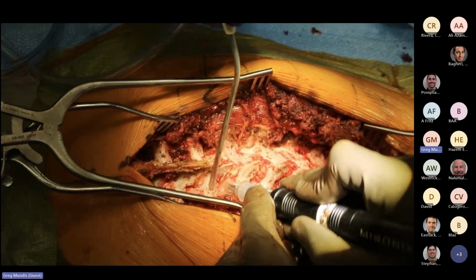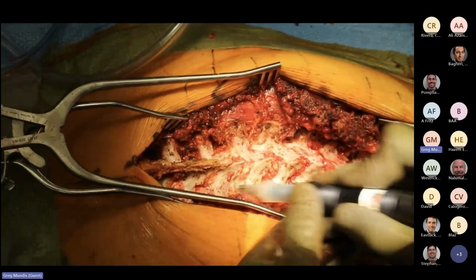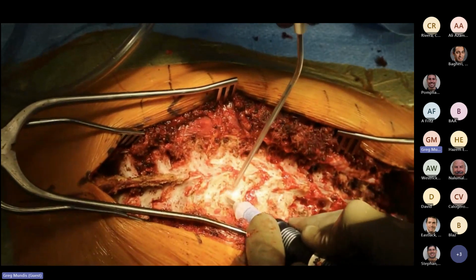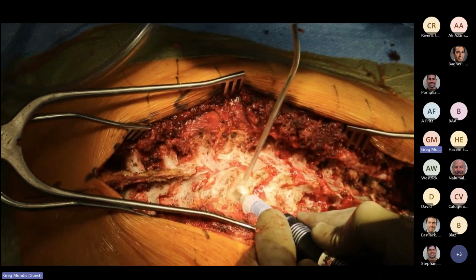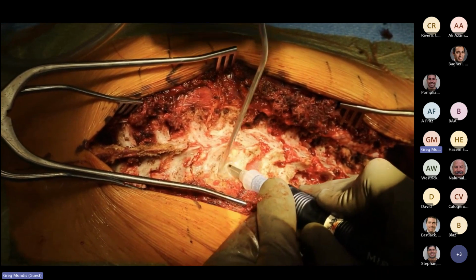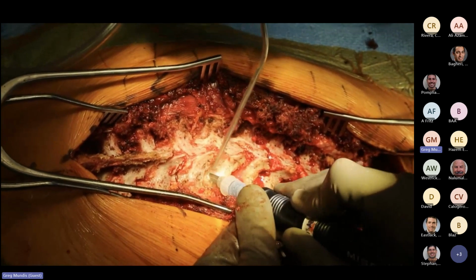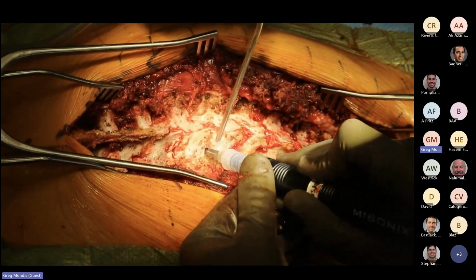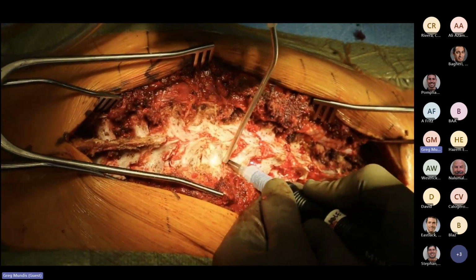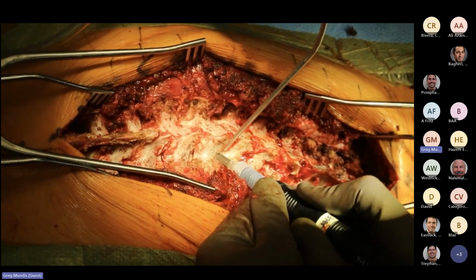So this is when we go to the next level of release, and you can see here where I'm cutting the superior articulating process, and we've taken down the interspinous ligaments here. So we've taken down part of the spinous process already, part of the interspinous ligament, and now here we're taking down the superior articulating process. And the idea here is that you're, again, sequentially releasing the spine.